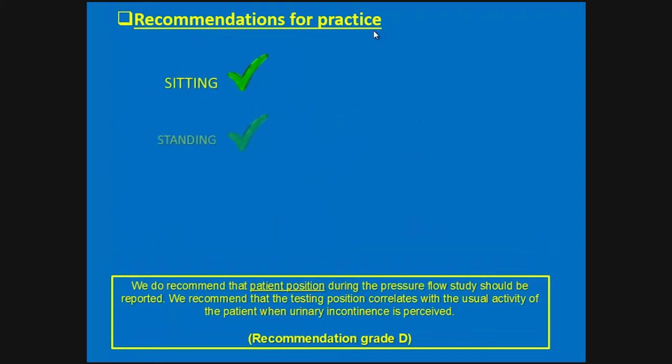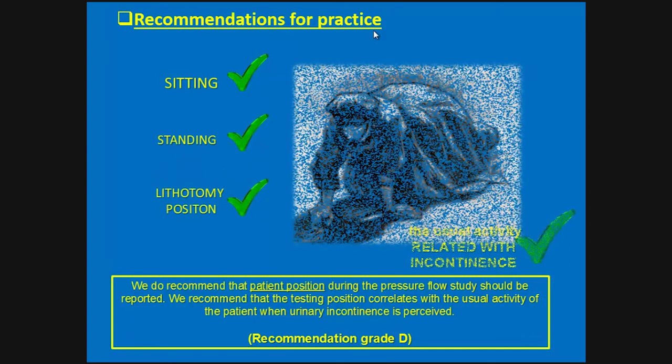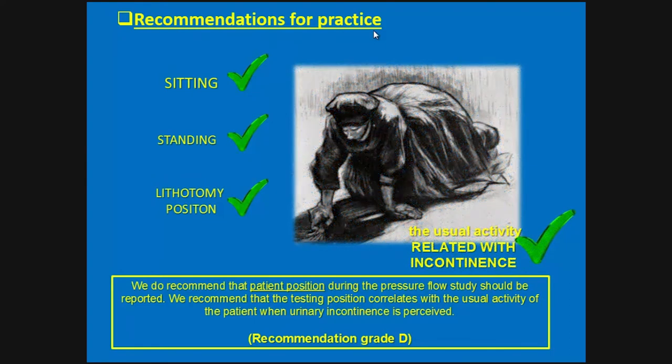In case of the position, we said before that the patient should be seated in an upright position, but in case you use another position for this patient, you have to declare it. It has to be pointed out in a urodynamic study if it is sitting, standing, or in lithotomy position. It should be reported. We recommend that the testing position also correlates with the usual activity of the patient when urinary incontinence is perceived.